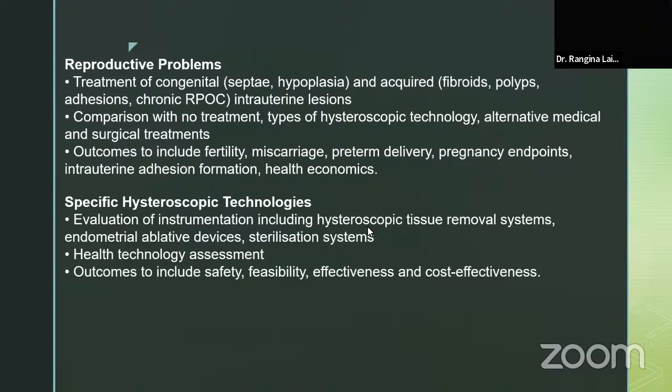And yes, about fibroids, polyps, adhesions, chronic retention of RPOC, intrauterine lesions, hysteroscopy-guided treatment is just a boon to the females of today's scenario, because we have seen many cases of septa which have not been repaired, patients who have undergone abortion more than 5, 6, 7 times, and lots of investigations, karyotyping, all the blood investigations, all the TORCH investigations, but still hysteroscopy was missing out.